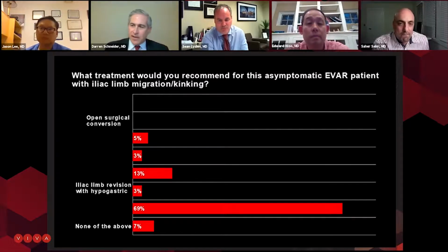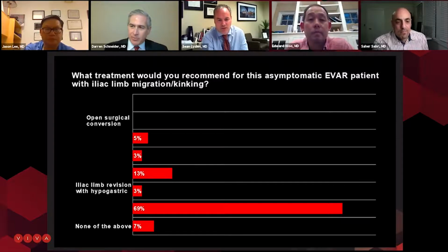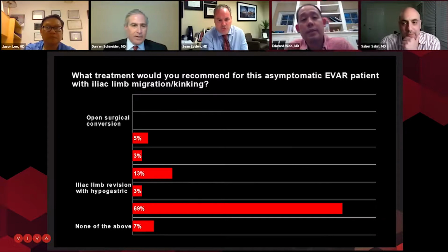And so not in a 65-year-old, but if I had somebody who was 85, who had a large AAA and kind of an ectatic iliac that was around 2 centimeters, I'm not going to put an iliac branch in that guy. I'm just going to put in a flared limb and get him off the table, because that's likely to be all he needs. And Saher, that's a great point, right?